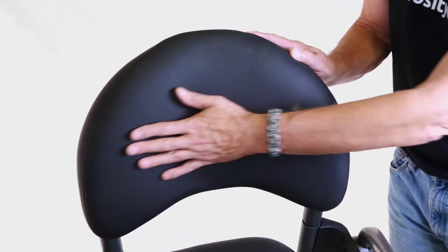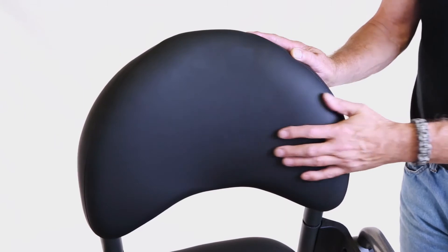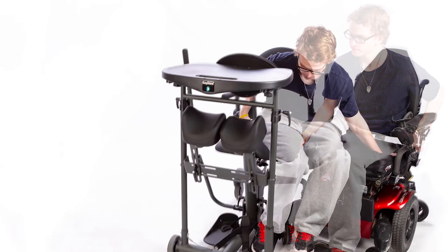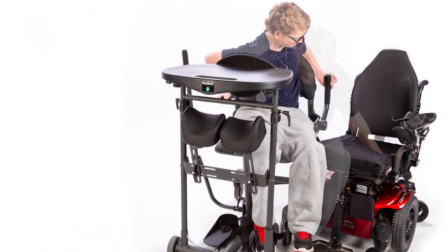The backs and the seats on the Easy Stand Evolve are covered in Dartex material, which makes cleaning easy and has good frictional properties for self-transfers.